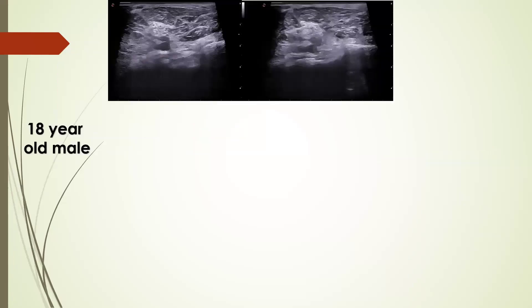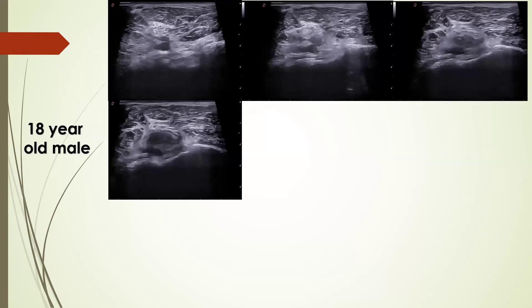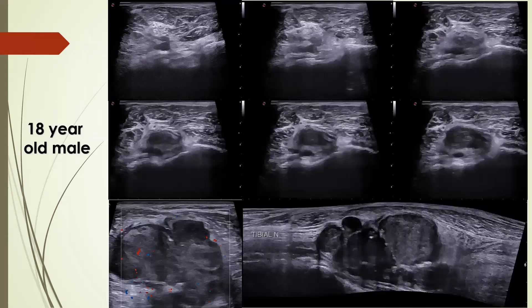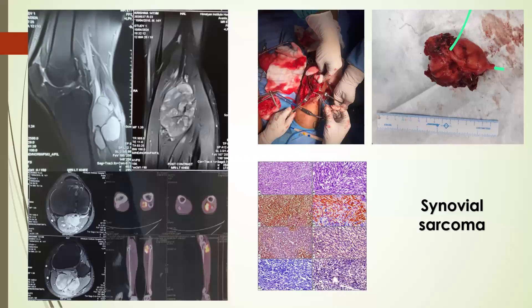In another case, an 18-year-old male had a mass in the popliteal region that was splaying the nerve fascicles of the tibial nerve, with the tibial nerve seen entering and exiting the lesion. We suspected a nerve sheath tumor, but on histopathology it turned out to be synovial sarcoma. Synovial sarcoma can be encountered around the knee joint, and the knee is quite frequently affected by synovial sarcoma compared to other joints.